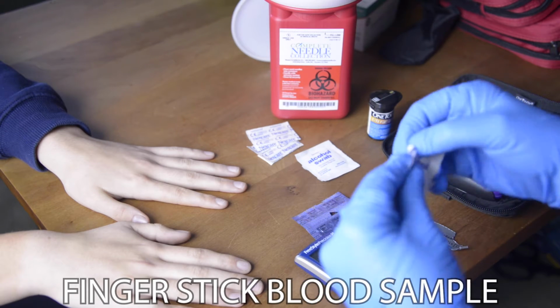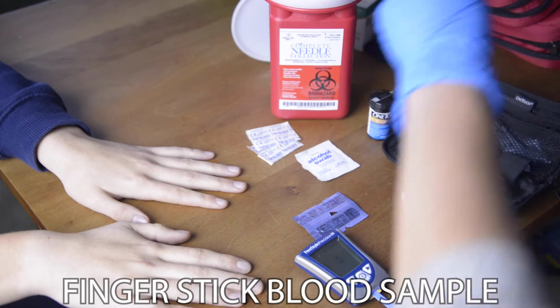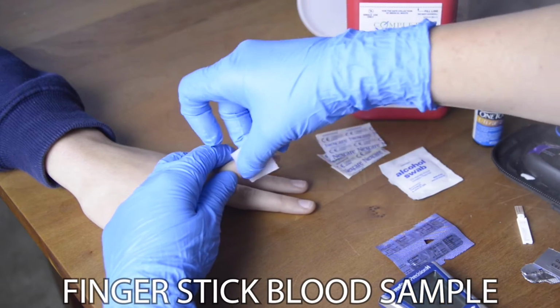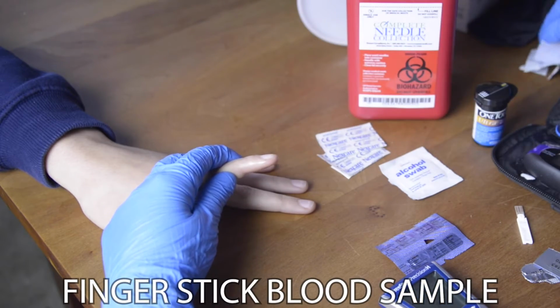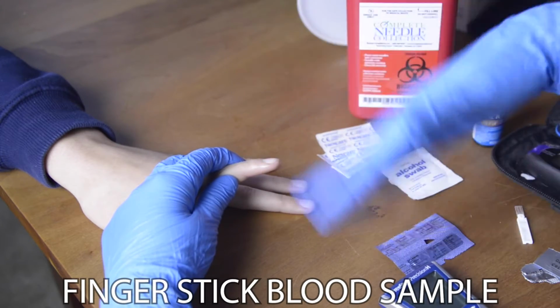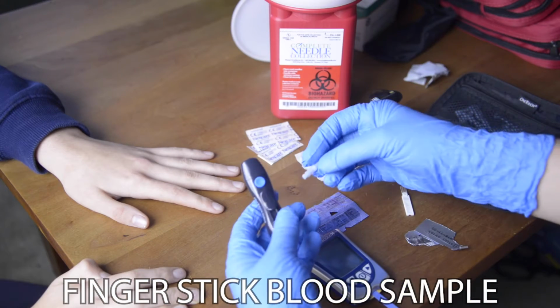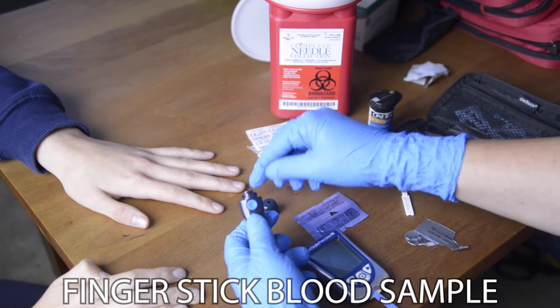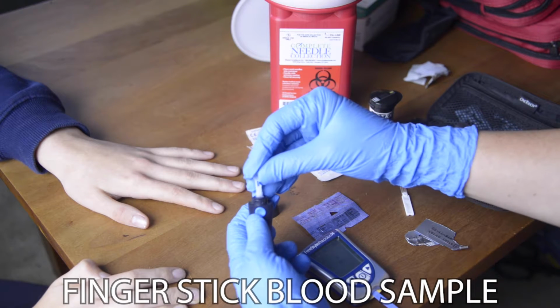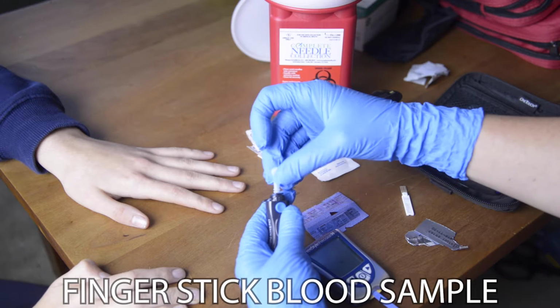Now generally, if they're right-handed, it's nicer to test on their left hand. And you want to test on the side of the finger rather than the front of the finger. So I'm going to wipe it with alcohol, fan it, let that dry while I set up my lancet. The lancet is a spring-loaded device that has a needle inside it.